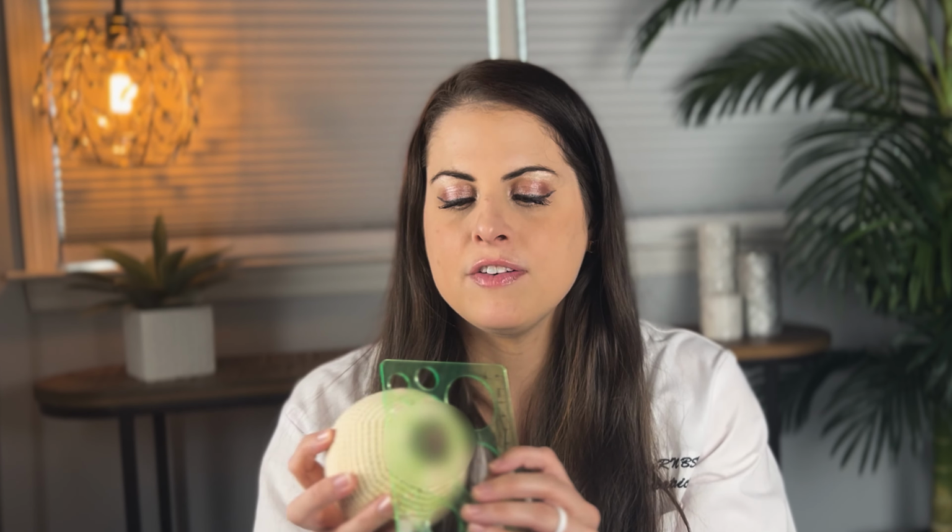You really just want your nipple pulled into the pump, and that will give you the best milk output, because the pump could pinch off some of the milk ducts, which are around the areola area, and it's just better for it to be a more snug fit when it comes to breast pumping. So you really just want to go off of which size fits the nipple best.